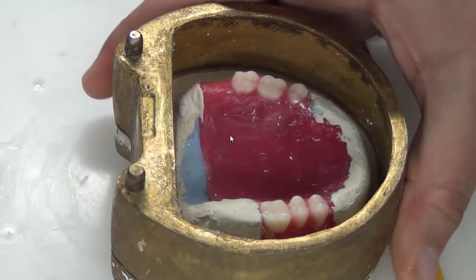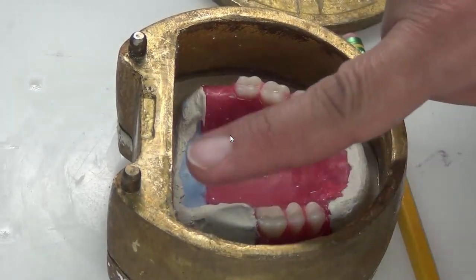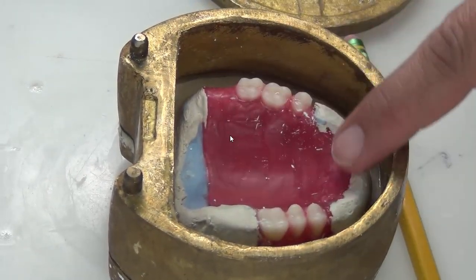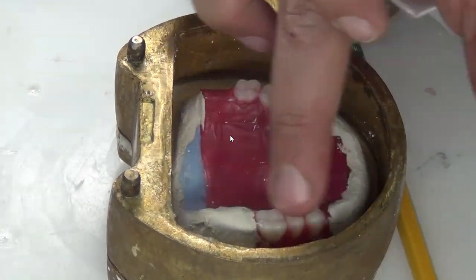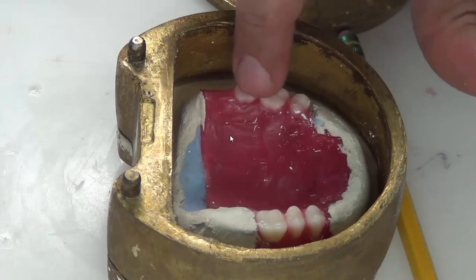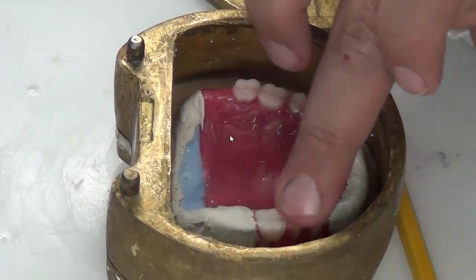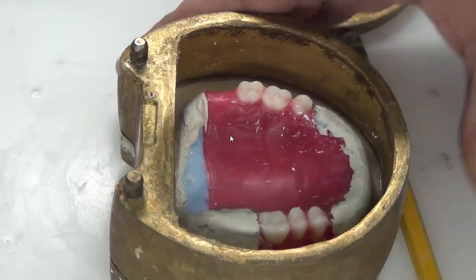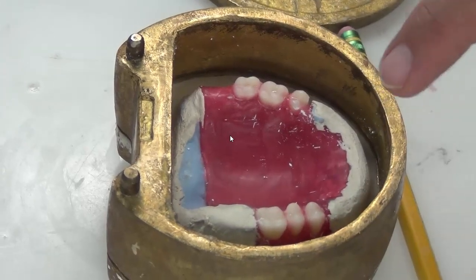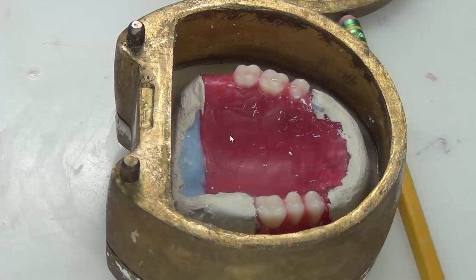We are going to use the vibrating table. We keep pouring in the stone until it is almost level with the teeth. We stop adding, and then we re-expose the occlusal surface of the teeth if they are covered with some remnants of stone. So we want to expose the occlusal surface of the teeth totally. Now what do we see after this second layer is added? We will not see anything from the cast or the wax. We will only see the occlusal surfaces of teeth. Okay? So you may begin the step now.